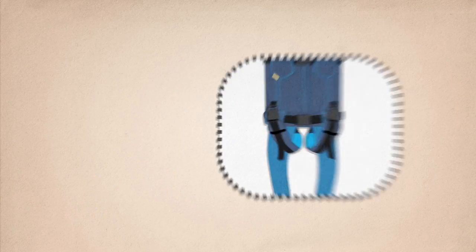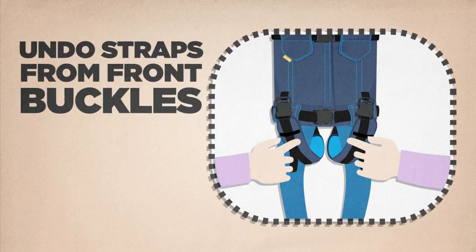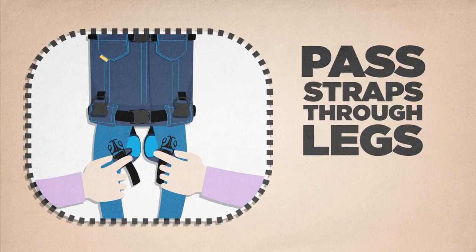Lay your child down on a comfortable surface. Undo the leg supports from the front buckles and pass the straps through your child's leg to the back.